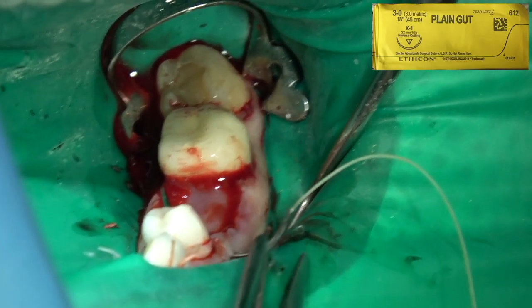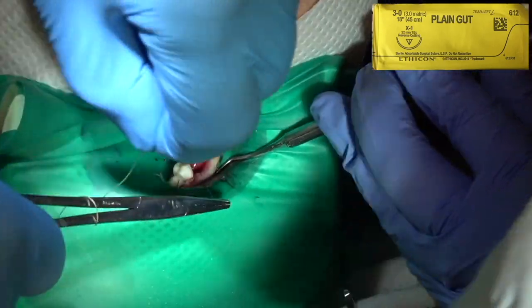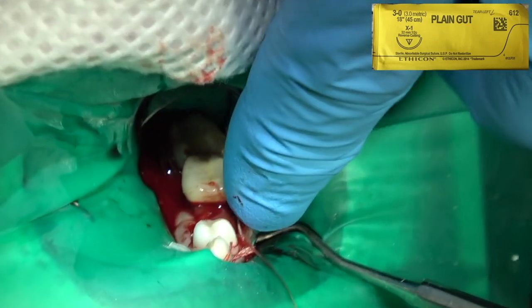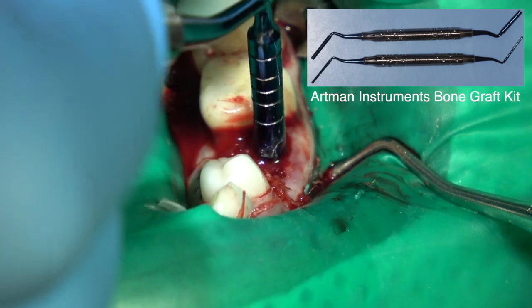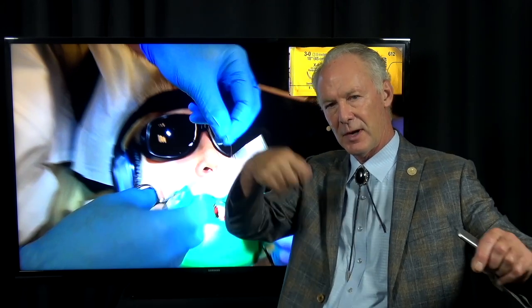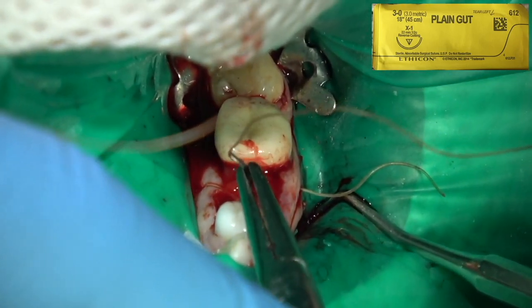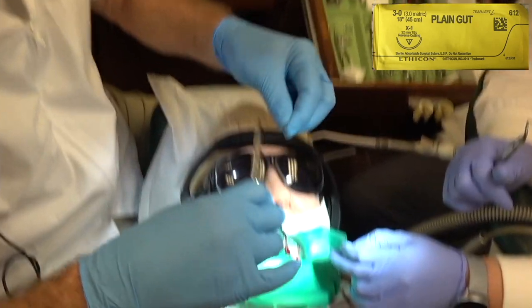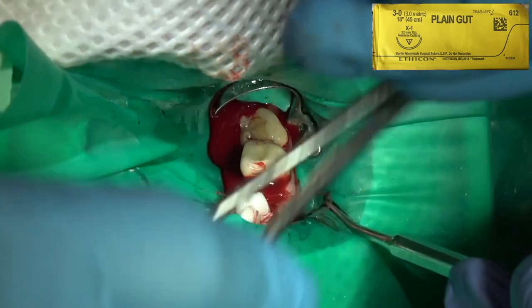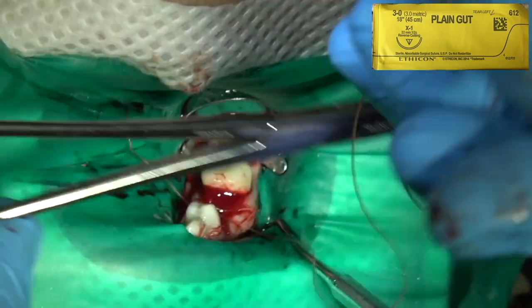This is 3-0 plain gut suture — it'll dissolve in three to seven days. Don't blanch the tissue because you don't want it to pull through; just snug. I'll place three sutures. Key point with suturing: once you place the suture through and you're tying it, go one, two, three away from you, then one towards you, then one wrap away from you. If you just go one, two away it won't stay snug — it'll loosen. Going one, two, three — keeping the suture rather tall as you do that — then one and one makes it really tight. Try to place the knot on the side of the incision, not right over the extraction site, because it'll accumulate food debris and plaque.